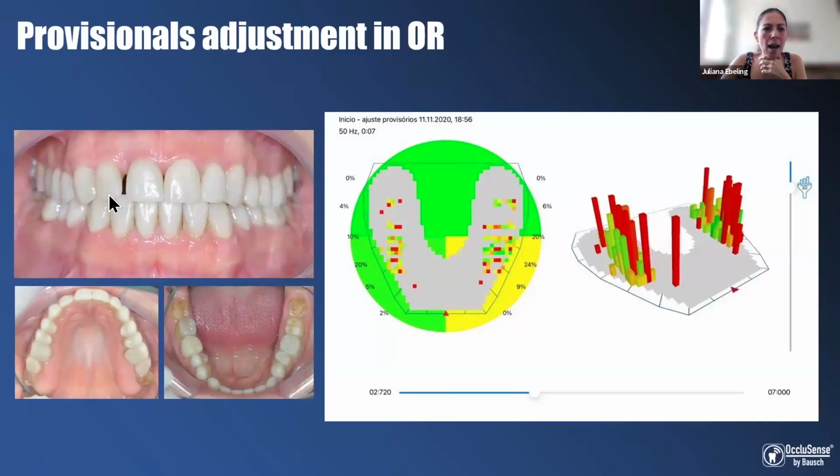So I gave conditions where the periodontal disease was controlled, and then I needed to move these teeth into a better position to rehabilitate the esthetics and function. And then I have no contacts between the anterior teeth in this phase, and I could improve the crossbite here, and then I have a reference to correct the curves, so the orthodontic treatment can start.